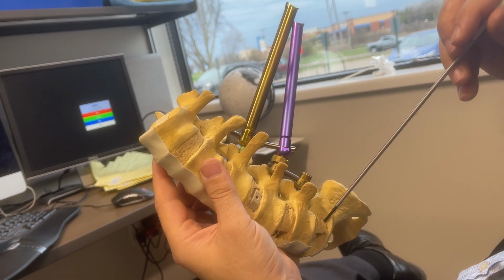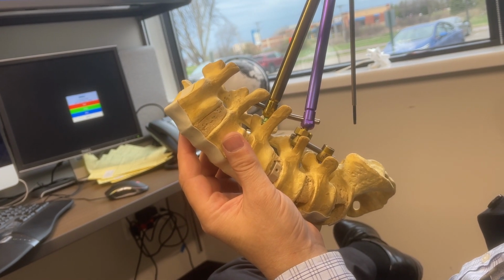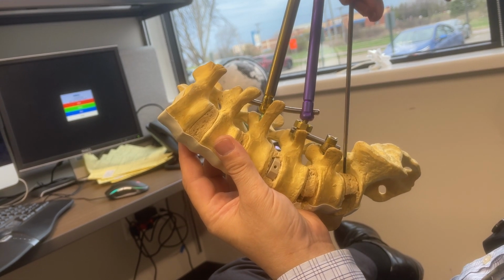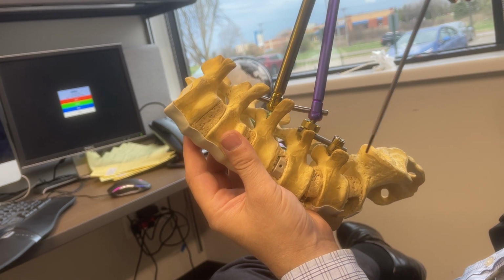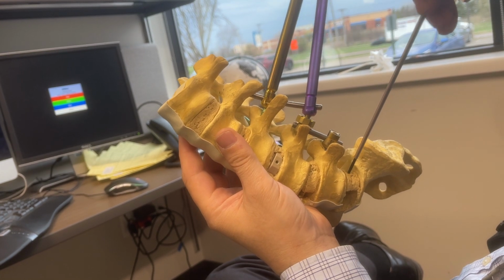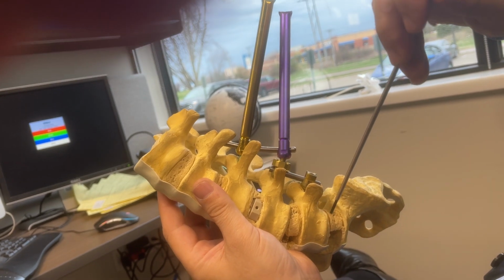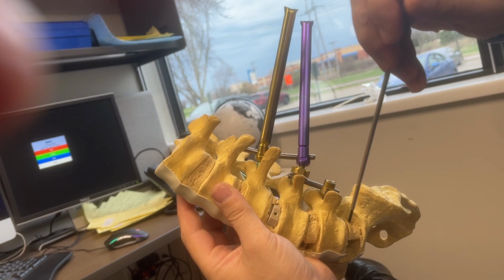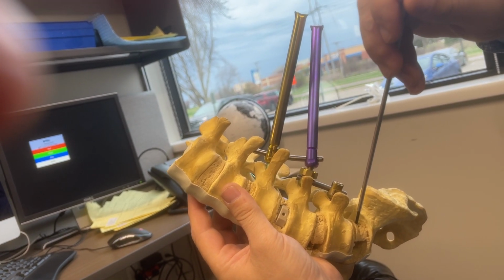At L4-5, L5-S1, I always try first to use the iliac crest as my guide, then you feel that bump here. Then I use the ala as my guide and go in, but if there is a huge bone growth here and that is completely obscured, I go a little more lateral. Again, I use the iliac crest as my guide, and then I am anterior to the nerve root and not in the Kambin triangle, and I perform a direct lateral fusion in prone practically on L4-5, L5-S1 all the time. And we published that paper almost 7 years ago.